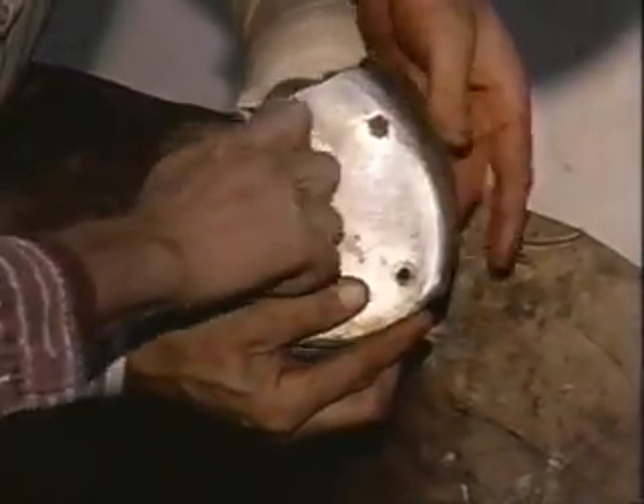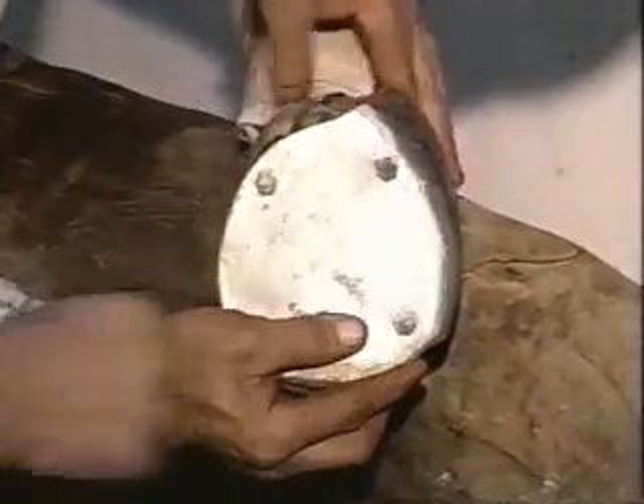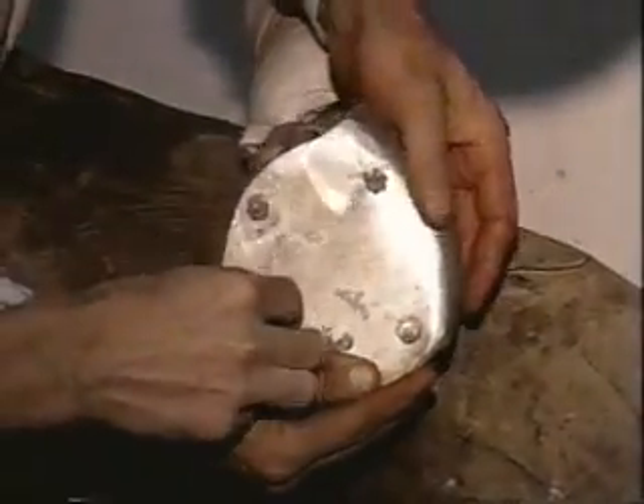Now, as I'm putting the bolts in, I'm also pushing the putty in around the edge to create a nice, uniform fit.